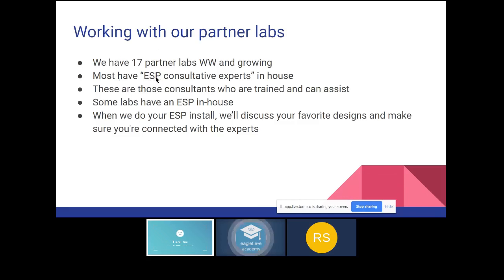So most of the labs have what I call an ESP consultative expert, and I'll use B&L as an example. Andy Taddeo is the consultative expert at B&L for ZenLens and ZenRC, and in early December we're going to train a couple more guys, so we have a bigger team over there. But anyway, there's people that understand what's going on with the ESP.